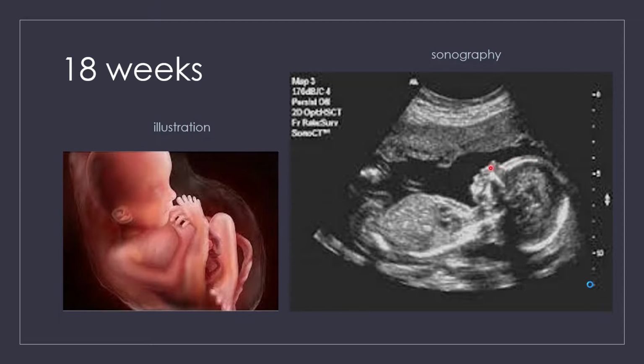See a cute little profile there. Here's the fetal heart. Okay, this is a diaphragm here. This is lungs. This is the fetal liver. And obviously this is fetal brain. Now this right here is the placenta.